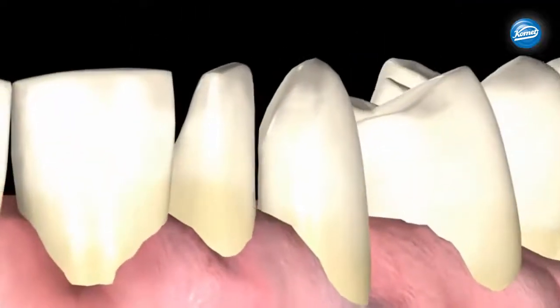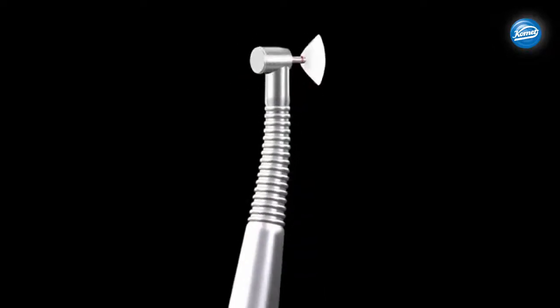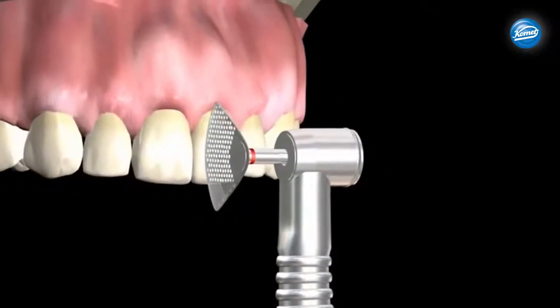The non-cutting side protects the adjacent tooth. The simplicity of the OS system allows the practitioner a simple solution performed in less time, providing a precision cut to produce clinical excellence for all patients.